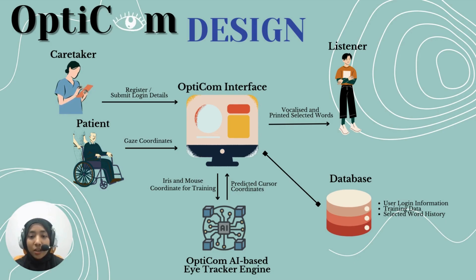After training, the algorithm can now begin to predict the cursor coordinates based on the user's gaze and ultimately select the intended words to be vocalized and displayed as outputs to any listener the patient is conversing with. The database of the system will store login information for authentication and training data for eye tracking calibration and the history of selected words for users' reference.